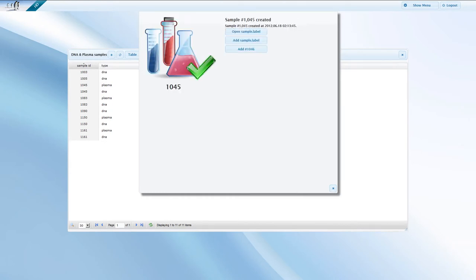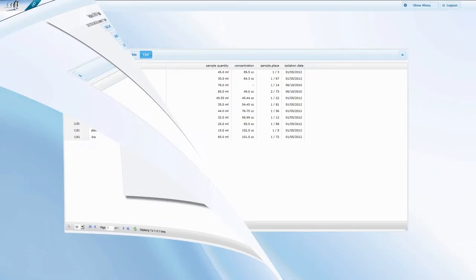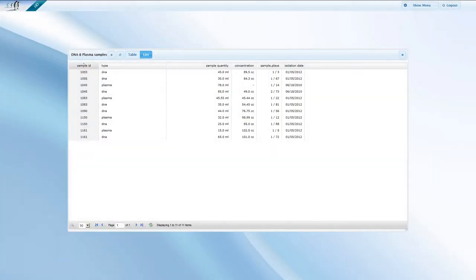The sample now is successfully created. Similar to the patient module, this popup window allows you to open the newly created sample and add a new one or add a sample to the next empty slot. As a result of this new sample creation, our sample list has been extended by two new items under the same ID number, a new DNA and a new plasma sample.